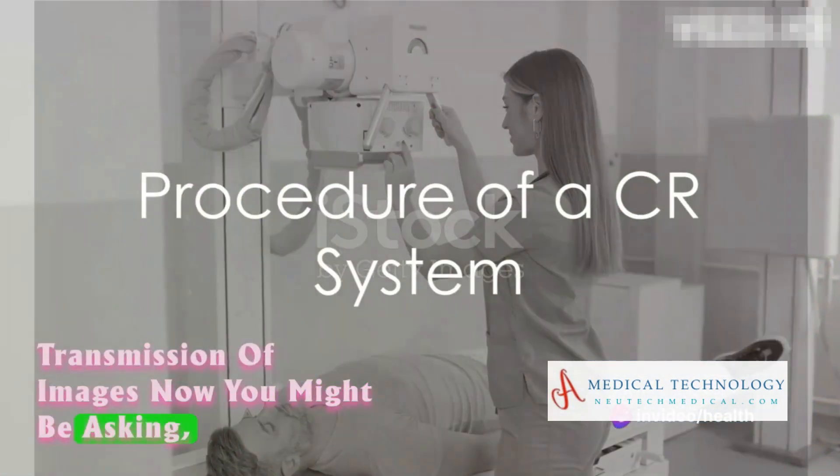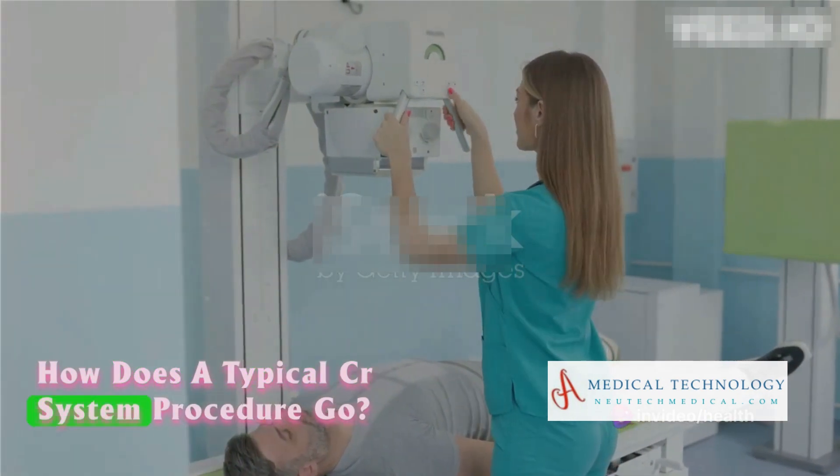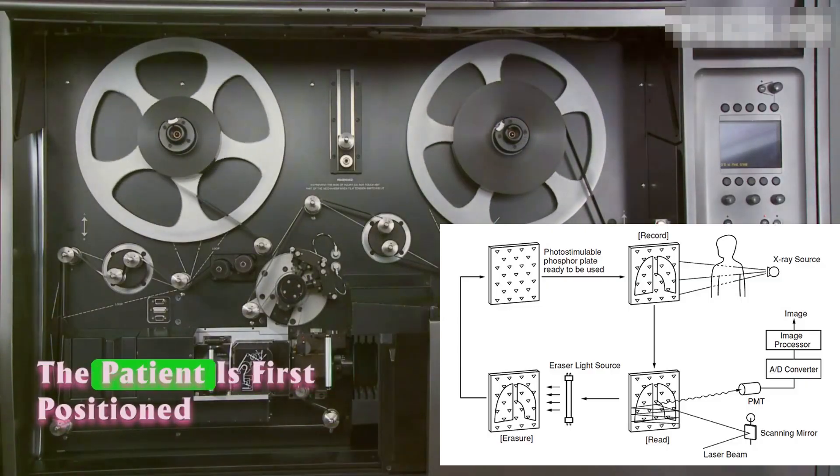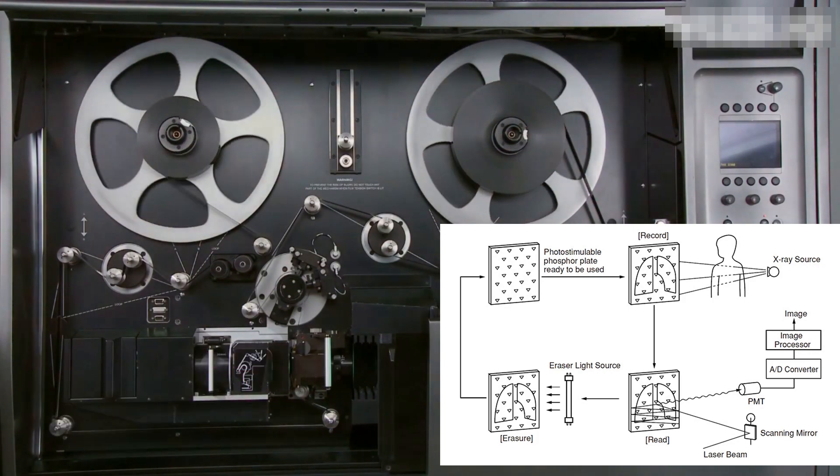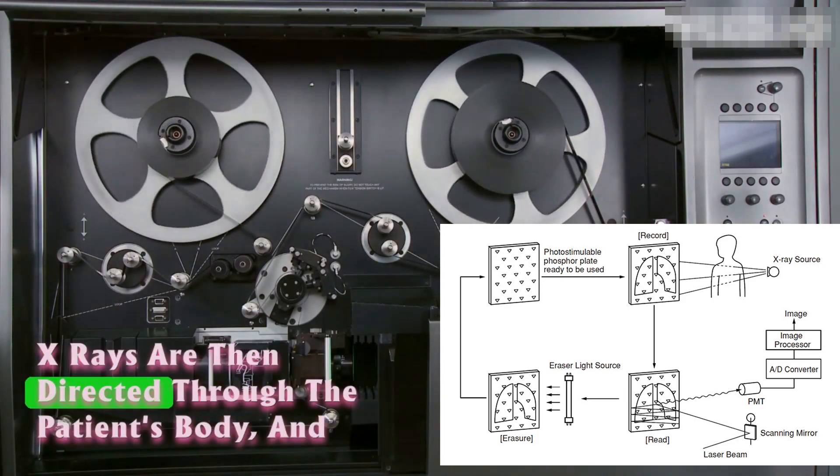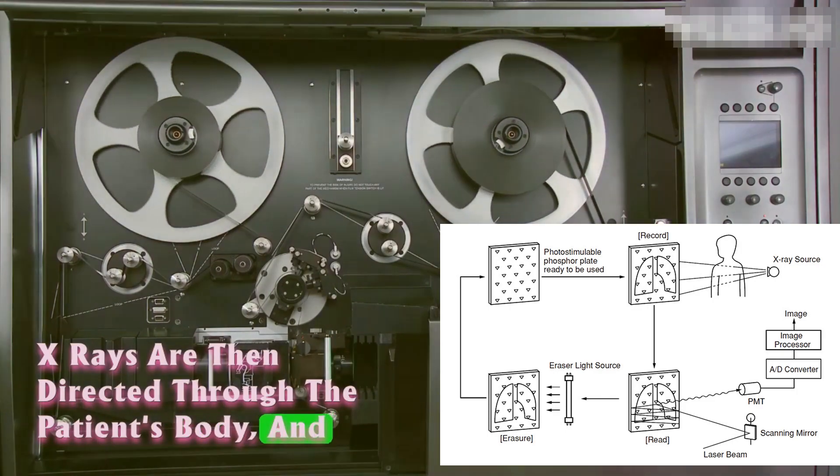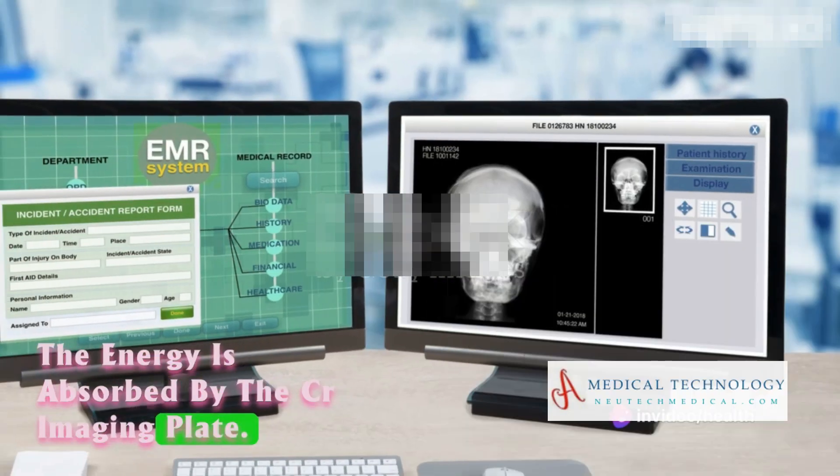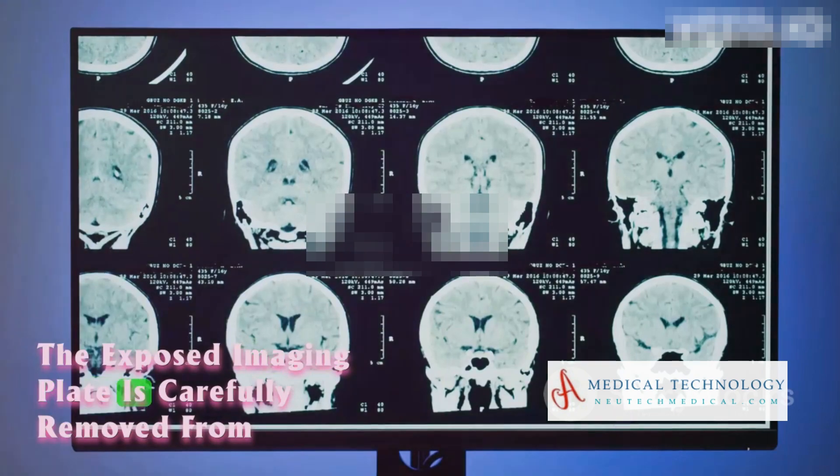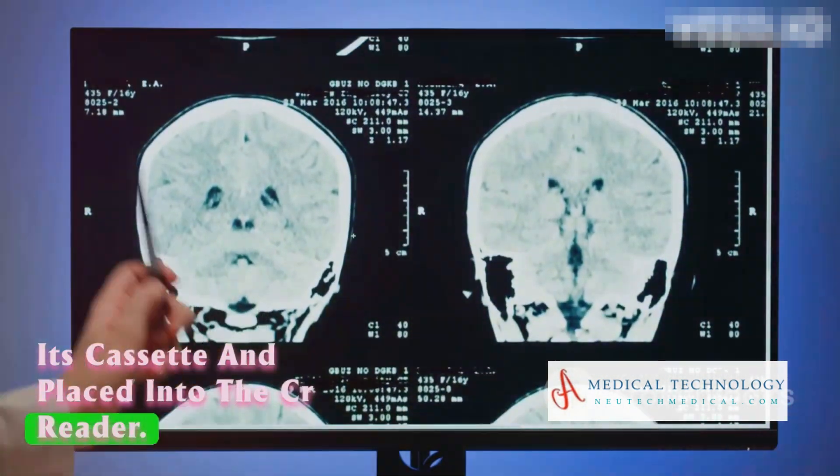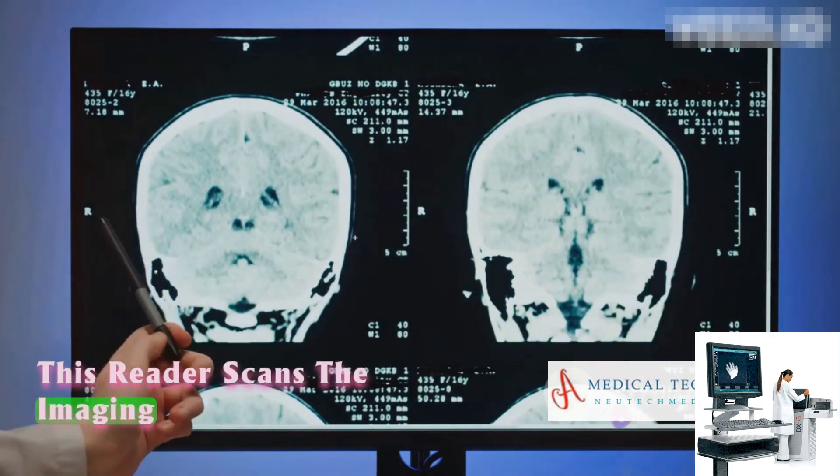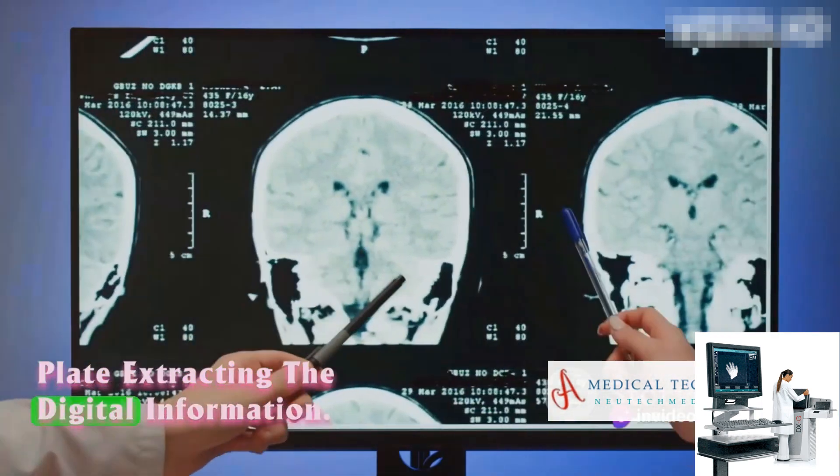Now, you might be asking, how does a typical CR system procedure go? The patient is first positioned for the specific radiographic examination. X-rays are then directed through the patient's body, and the energy is absorbed by the CR imaging plate. The exposed imaging plate is carefully removed from its cassette and placed into the CR reader. This reader scans the imaging plate, extracting the digital information.